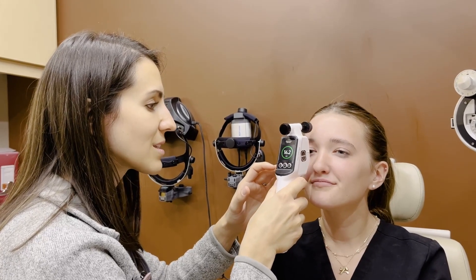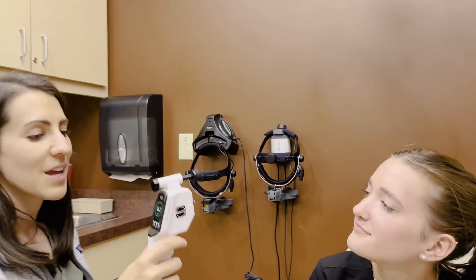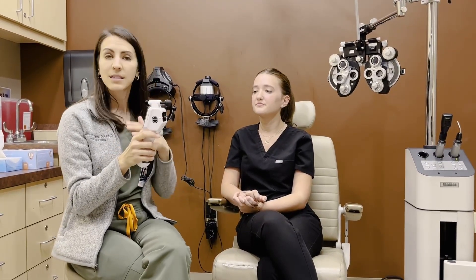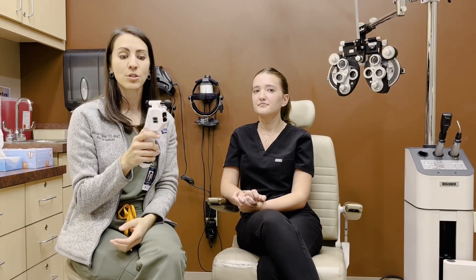It automatically takes those measurements and gives you the result. The results can be repeated — you can do either a series of three measurements automatically or six. It's also easy to take a second measurement average as well.